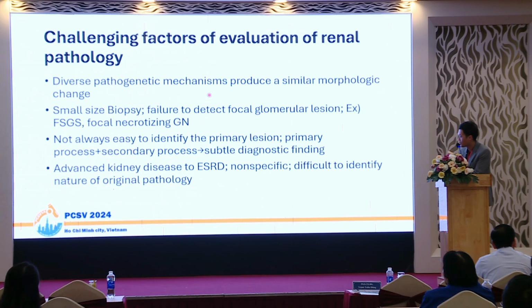And most of all, different diseases, when they are advanced enough, make very similar morphology. So if a patient is in ESRD or has very advanced kidney function test, the morphology looks very similar and very non-specific.